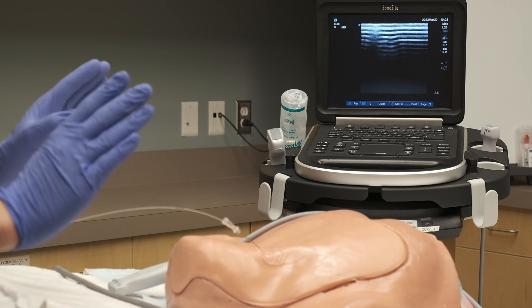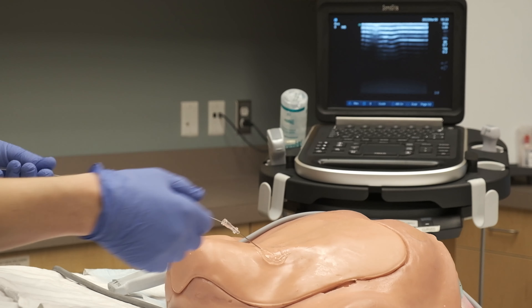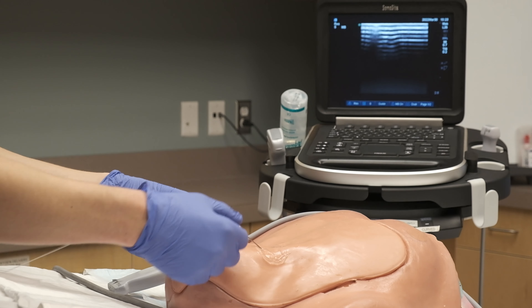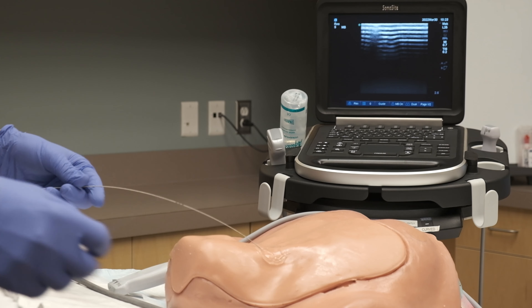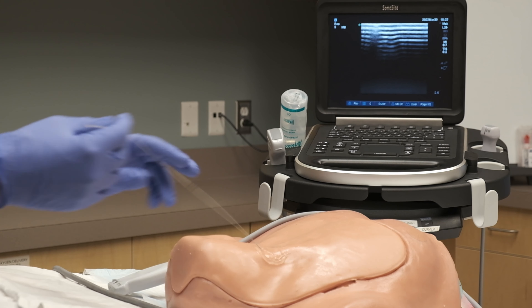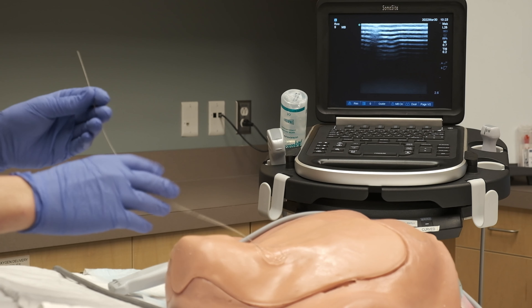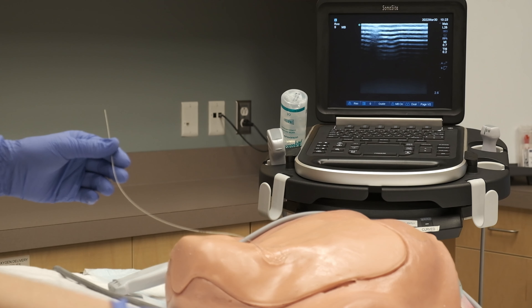The most important thing is to not lose your wire inside of your patient. So you need to hold the wire as you withdraw the needle. If you have lots of tail, the wire will not slip away into the patient, but it's important to be really cognizant of it, because it's a really big deal if you make this mistake.